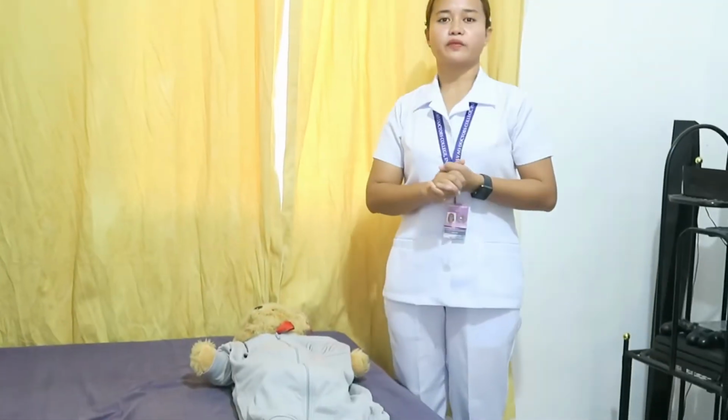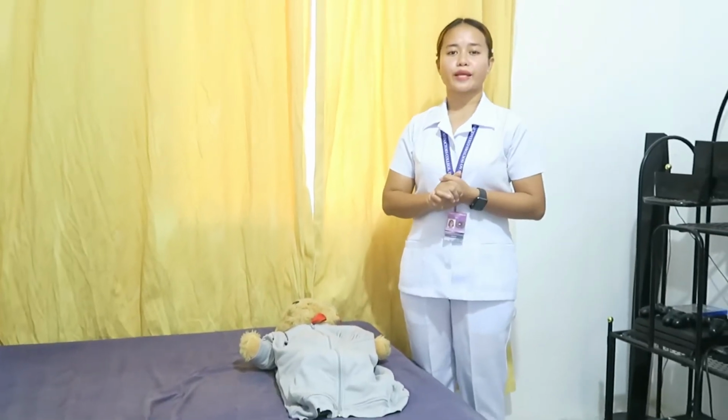Next is the adult breaths. So give 2 breaths with a barrier device. This is the barrier device, giving breaths via oral. This will allow the oxygen to go inside the lungs of the patient. Also, by using a barrier device, this will help the healthcare provider protect themselves from contagious diseases.